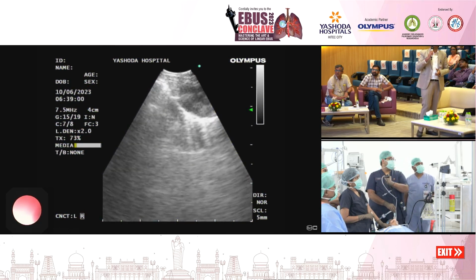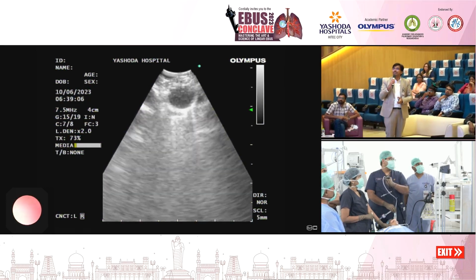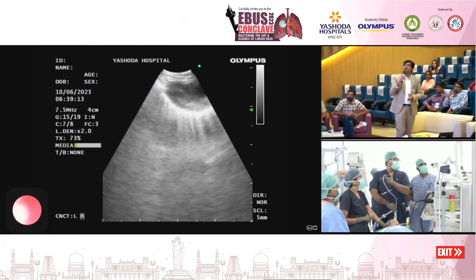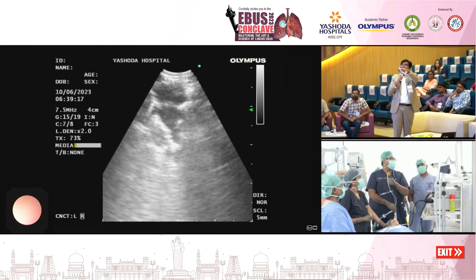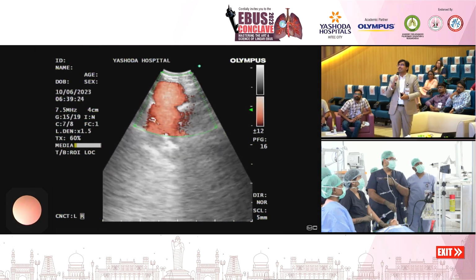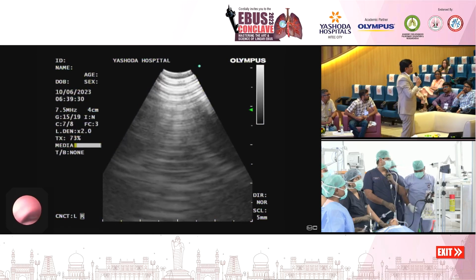That is the SVC down, sir. This is the azygous. Okay. I think here, not seeing the communication, but nevertheless. No, here, sir. Yeah, sure. Open Doppler. You can see the wall also. Remove Doppler. Okay. So I hope everybody is still awake, and if there are any last questions to the operators.